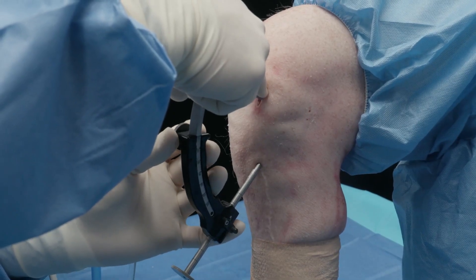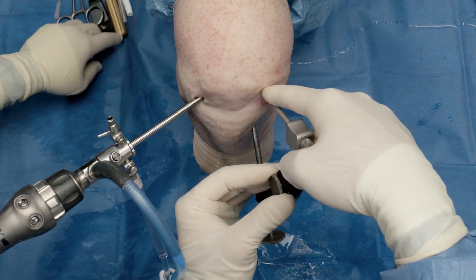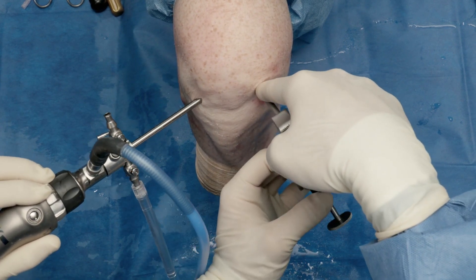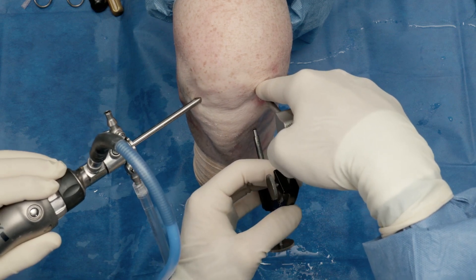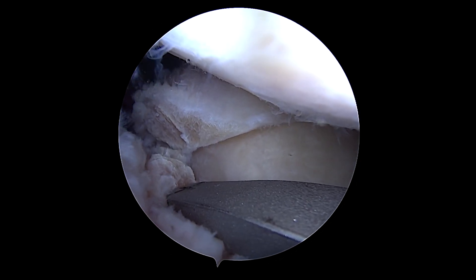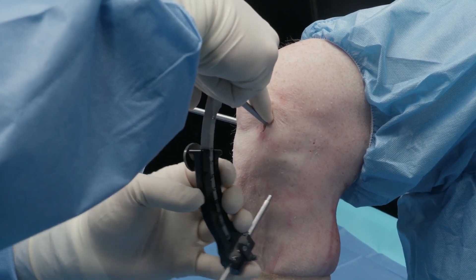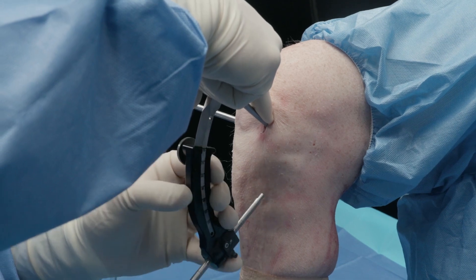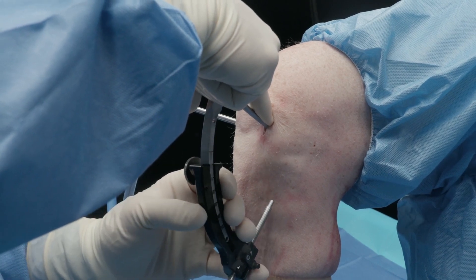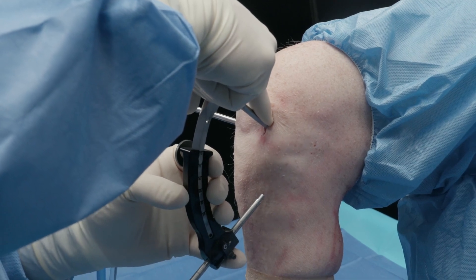You want to be about a finger-breadth medial to the tibial tubercle. In cases where you have combined procedures such as an ACL, we'll obviously be aware and trying to avoid coalescence, but in this case we'll just plan a small incision just one finger-breadth medial to the tibial tubercle. One of the great advantages of this transtibial root guide during concomitant procedures is that as the surgeon you have complete degrees of freedom — you can avoid your ACL tibial tunnel, and in an uncommon case of both medial and lateral you can really change your angle and position to avoid tibial coalescence without compromising the anatomic origin of your root.